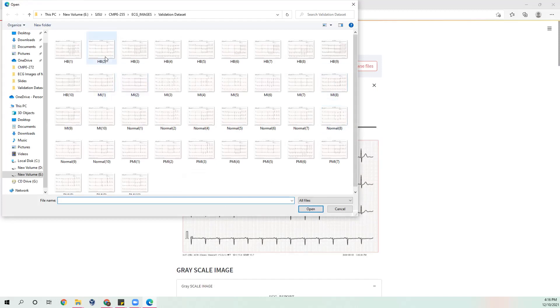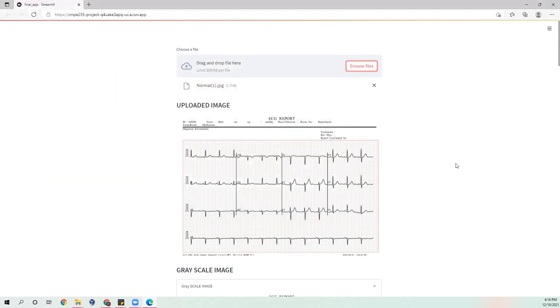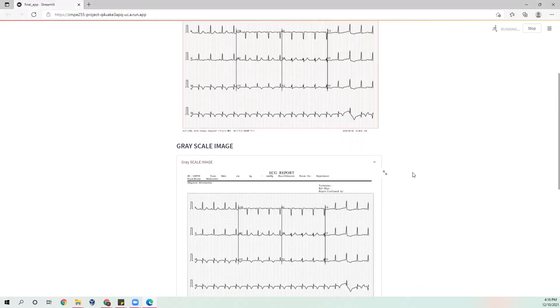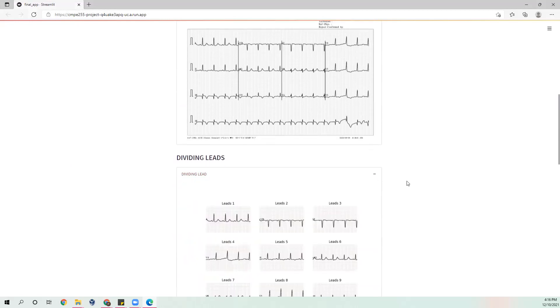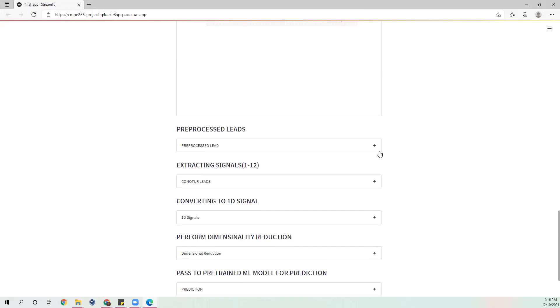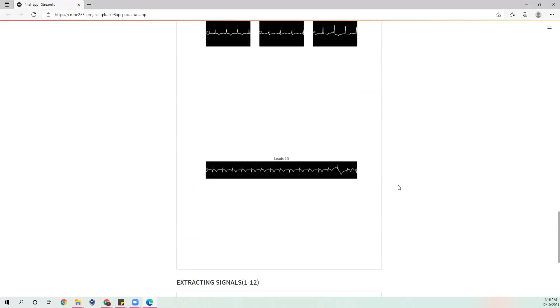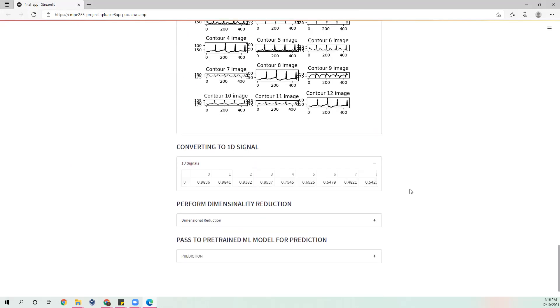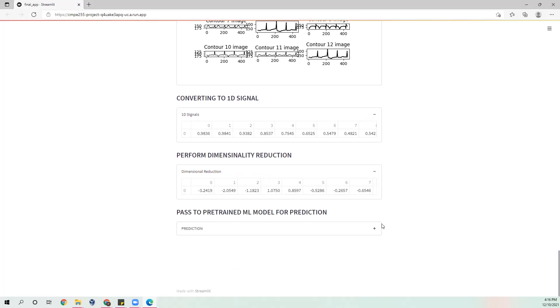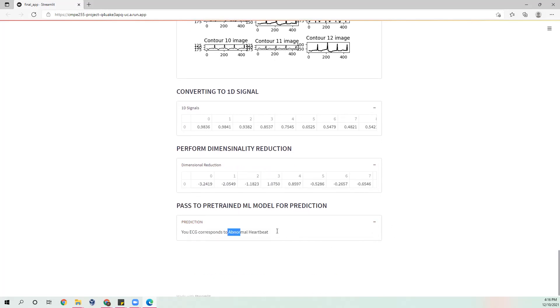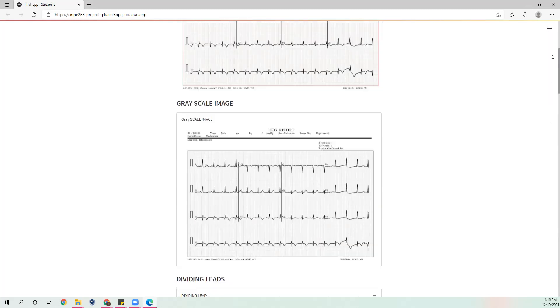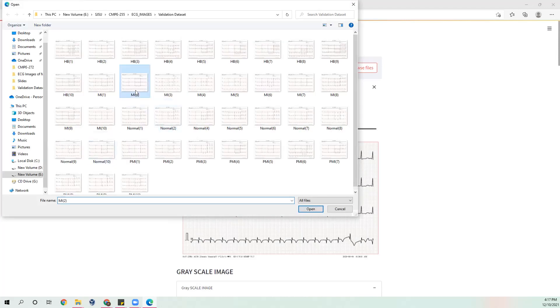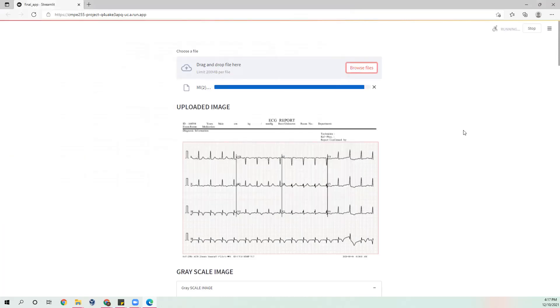Now I'm going to try different types of abnormal images. The prediction is abnormal heartbeat. I'm going to the next category of abnormality.